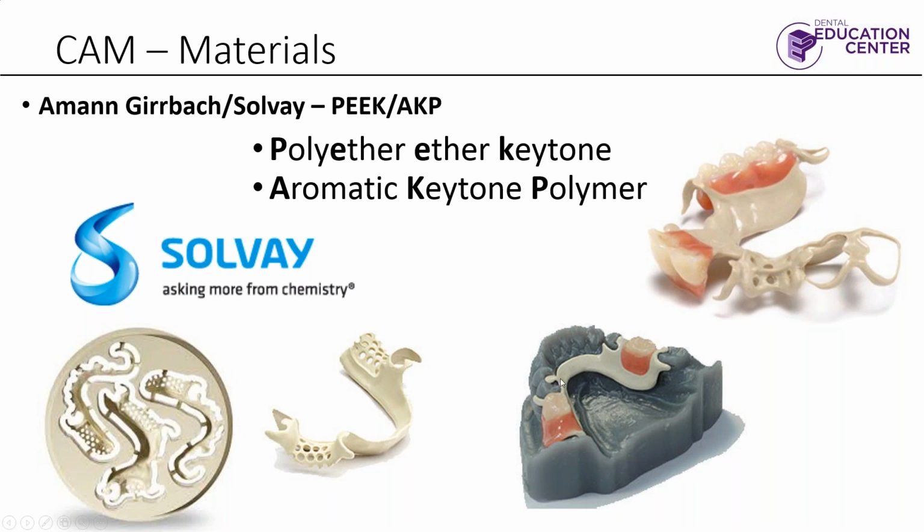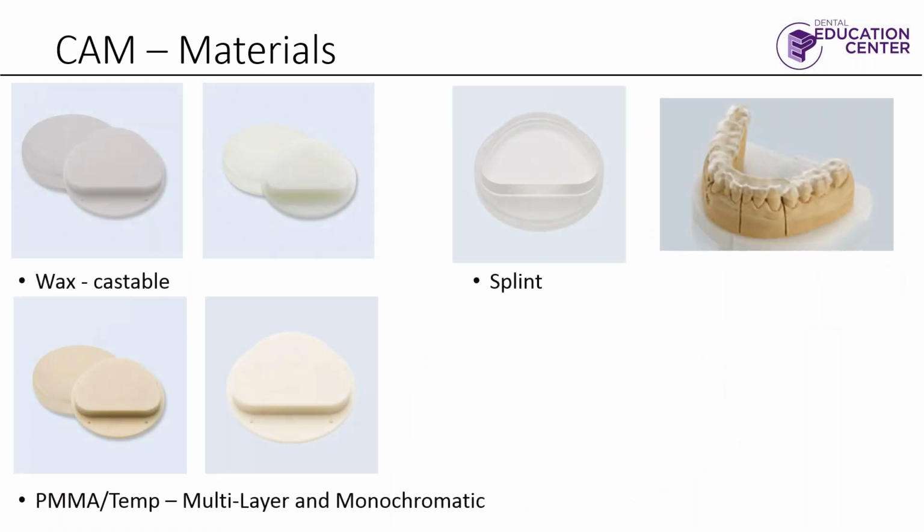These clasps will be a little thicker than metal, but we haven't had any complaints as far as patient discomfort because of it or whatnot. If they do break it, you just mill them another one. You already have the file, just mill another one and fabricate yourself, which is really nice.